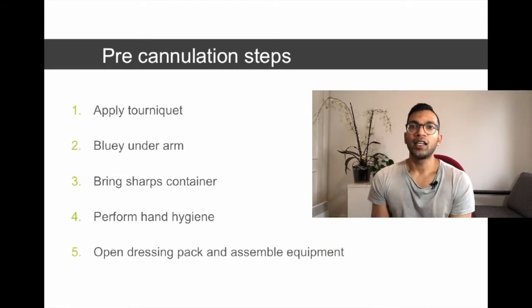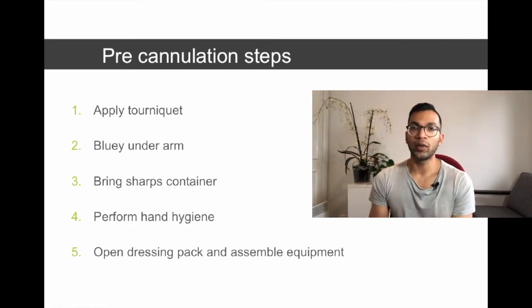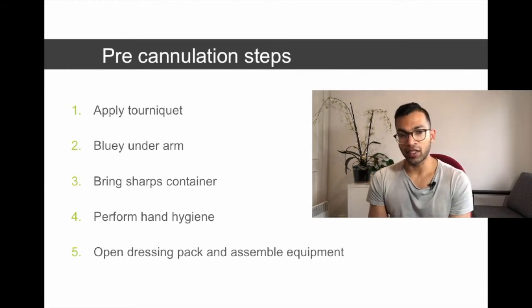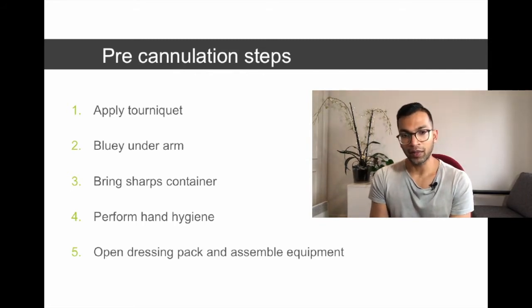So I'm going to go through quite a number of steps here, and in the actual practical video, you'll see all of these come into action. So first of all, apply the tourniquet. I do this first because you want a bit of time for the patient to try to enlarge that vein and cause venous dilation. I always encourage my trainees to put a bluey under the arm. You never want any inadvertent blood spilling over the patient or over the floor or the bed that they're in.